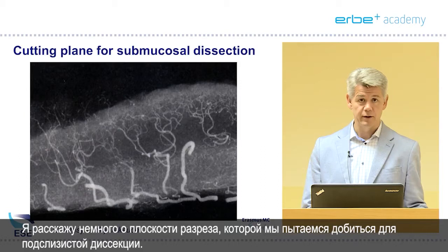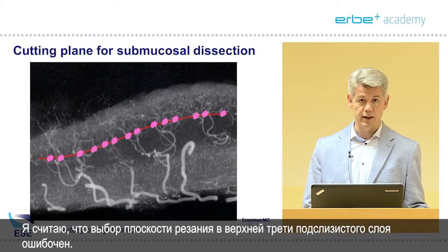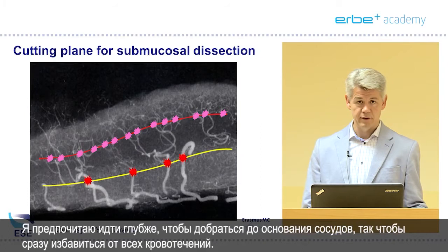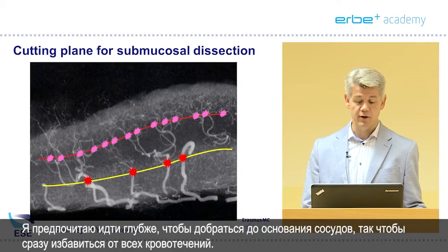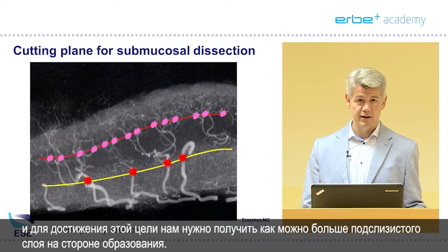I'll tell you a little bit about the cutting plane we try to get into for submucosal dissection. Cutting in the upper third of the submucosa is wrong — you will meet a lot of small vessels and have to treat a lot of small bleedings. My preference is to go deeper and treat the root of the vessel to immediately get rid of all bleedings. We also strive for an en bloc R0 resection, so you want as much submucosa on the lesion side to achieve that goal.